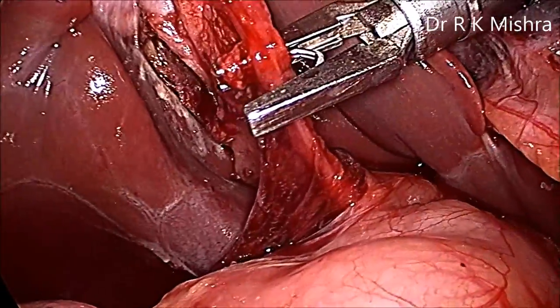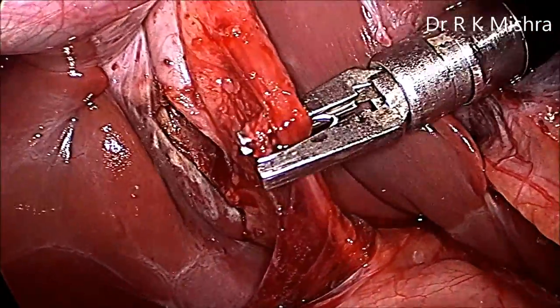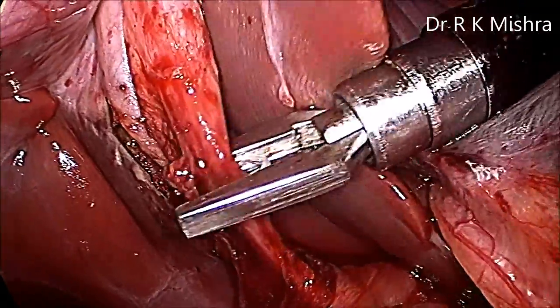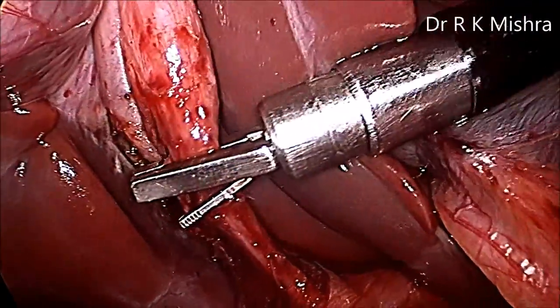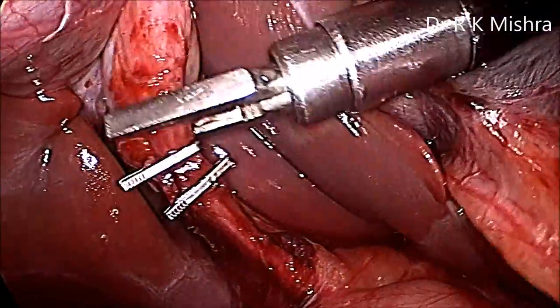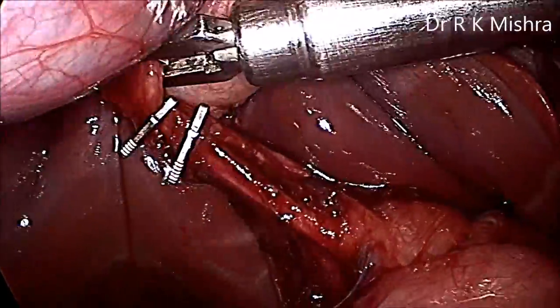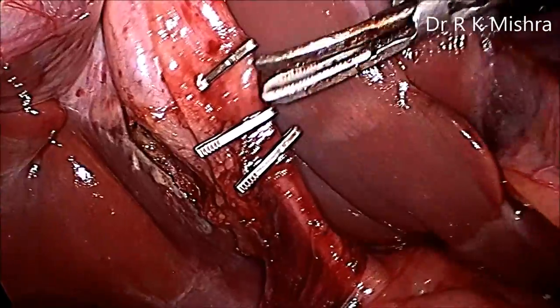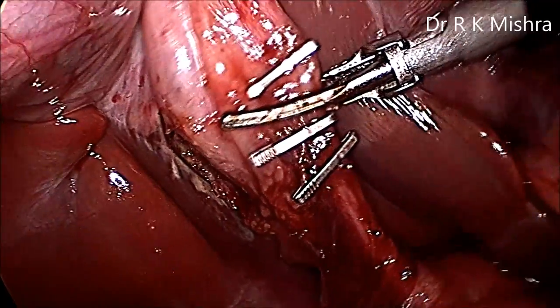Apply one clip towards the right hepatic artery, keep it pressed for three seconds to achieve plastic deformation. Then apply another clip three millimeters above that, and a third clip six millimeters above that. With the harmonic, sometimes we don't apply the third — you can secure it with the harmonic — but it is optional. Now with the harmonic we are cutting and separating the artery, and it is nicely separated.